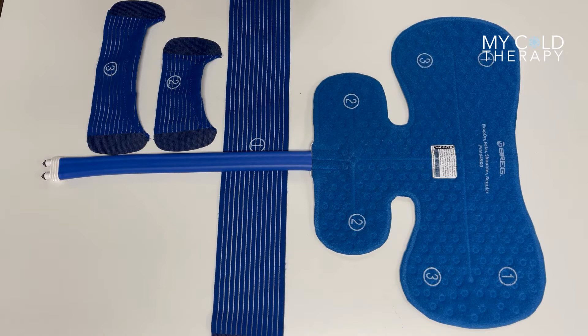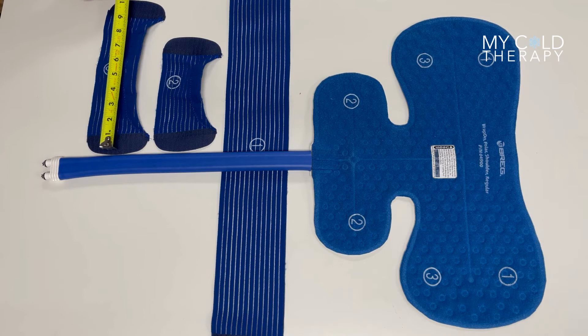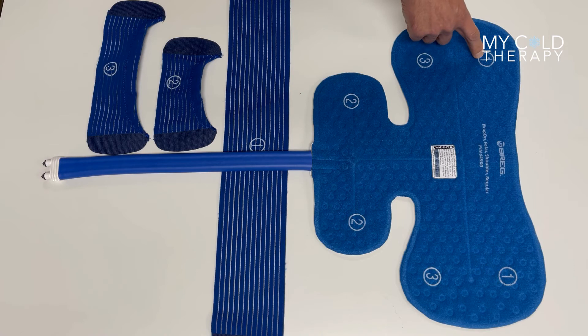This particular pad comes with three straps. Strap number one is 24 inches long. Strap number two is 8 inches. And strap number three is 11 inches. The straps go on the pad where the numbers are, so the straps match the numbers so you know where to put them.